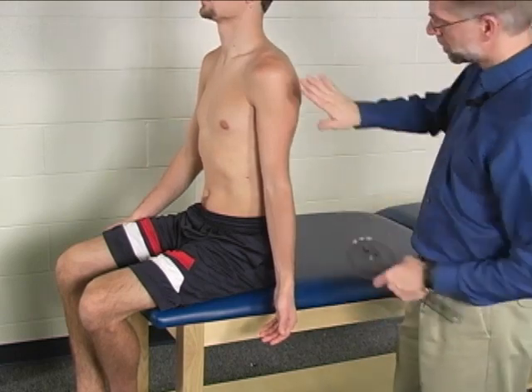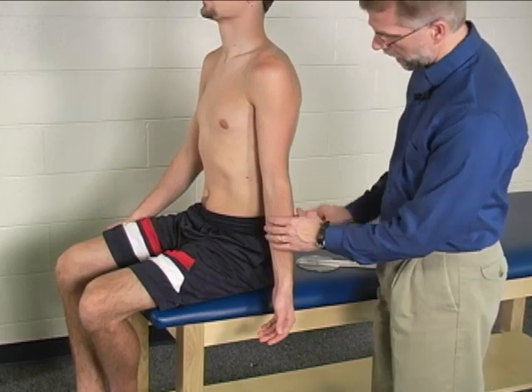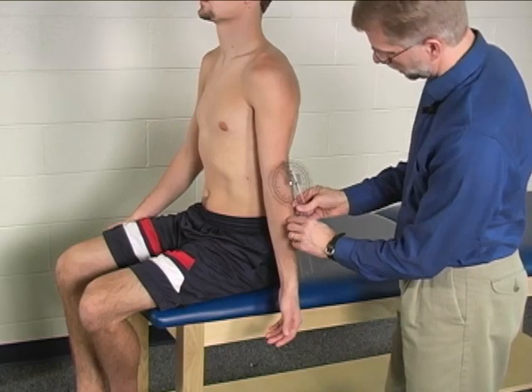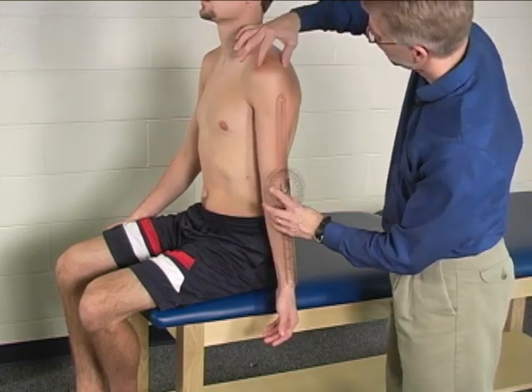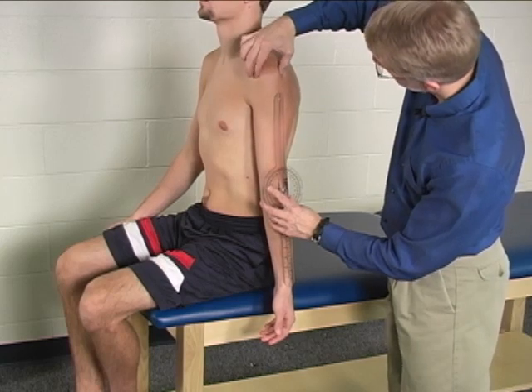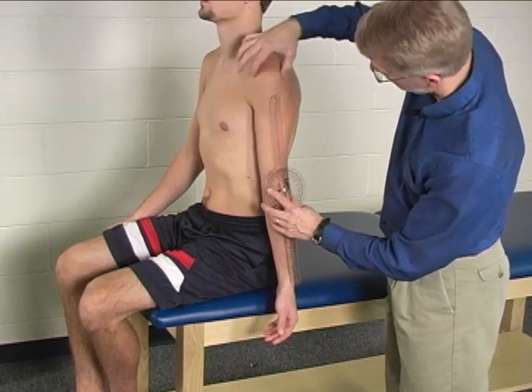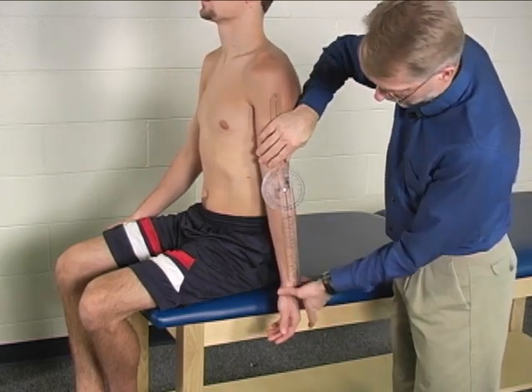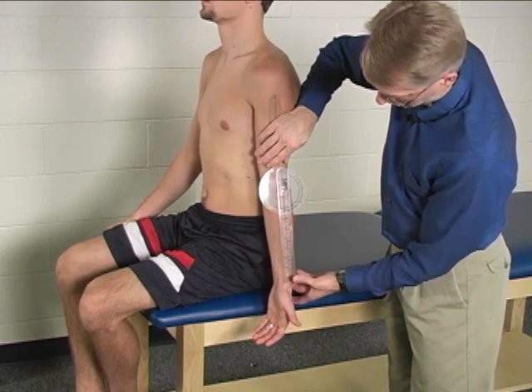The goniometer is placed on the lateral surface of the arm. The axis of the goniometer is placed right over the lateral epicondyle. The stationary arm of the goniometer is lined up with the humeral head, which in this case is not directly vertical. And the moving arm of the goniometer is lined up with the radial styloid, right there.